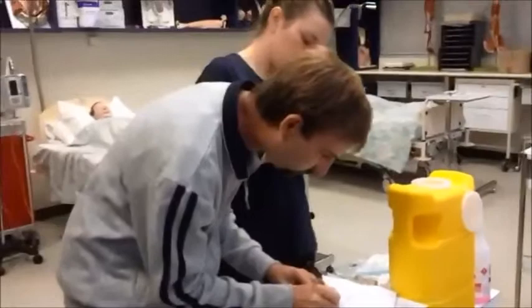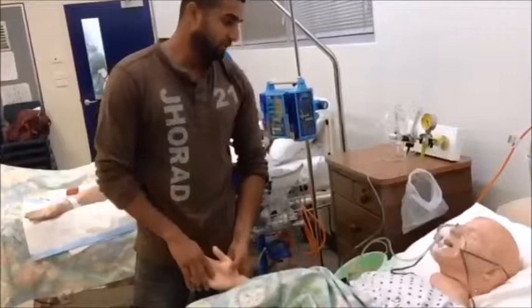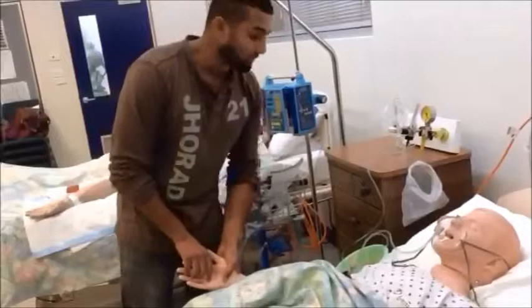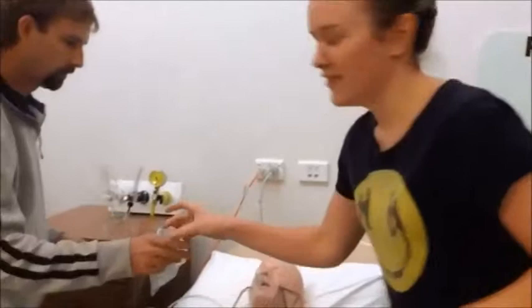Let's check the IV to see if he needs any IV therapy. I will check the IV. How are you feeling now, Mr. Weillow? They're just getting drugs for your pain and checking the drug chart and double checking. We're getting the GTN in. Edmund and Kathy are going to come in and give you something for the chest pain. So Eric, would you mind come and check with me? 0.9 normal saline — yes, that's right. One litre.